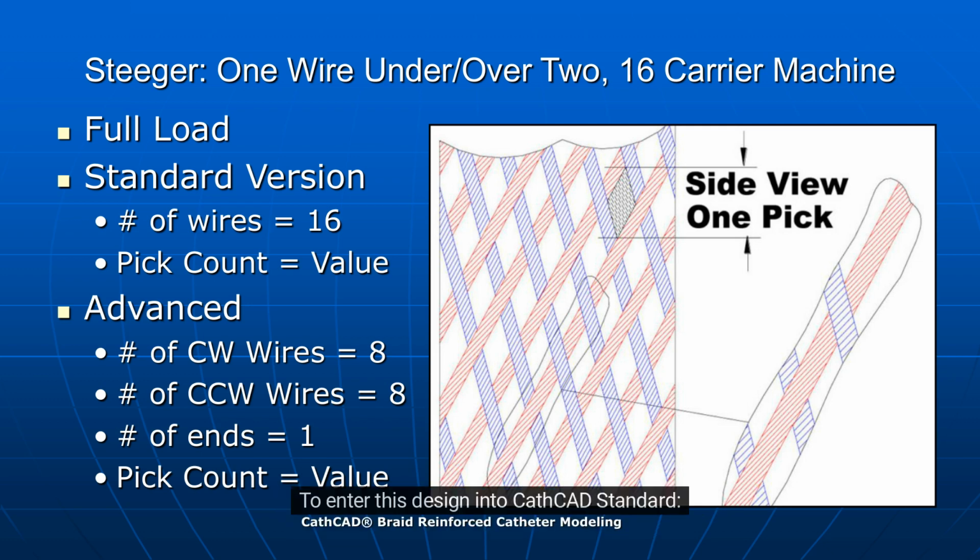To enter this design into CathCAD Standard, the number of braid wires is set to 16. The pick count entered should be that of the desired value. To enter this design into CathCAD Advanced, the number of clockwise wires is set to 8. The number of counterclockwise wires is set to 8.